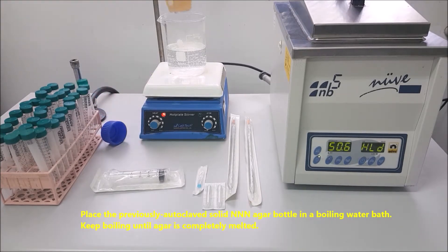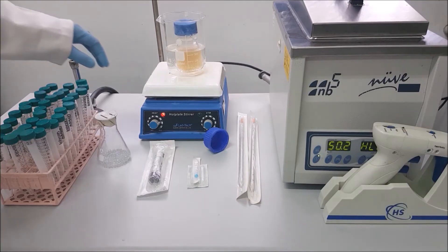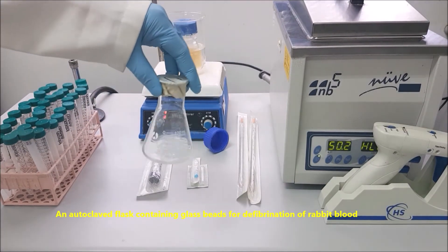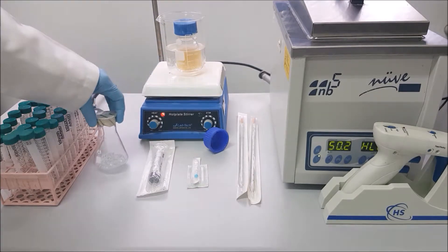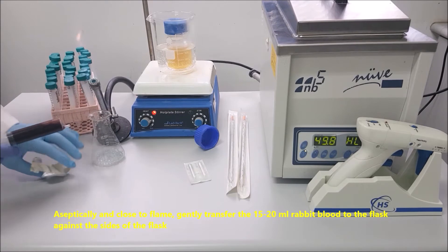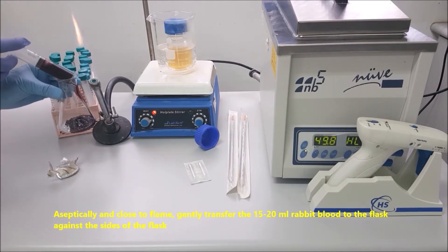Place the previously autoclaved solid triple N agar bottle in a boiling water bath. Keep boiling until the agar is completely melted — the bottle should be two-thirds immersed and loosely capped. Prepare an autoclaved flask containing glass beads for defibrination of rabbit blood. Aseptically and close to the flame, gently transfer 15–20 ml of rabbit blood into the flask against the side of the flask.